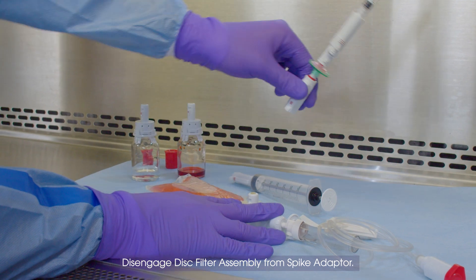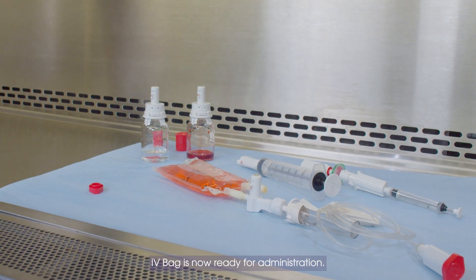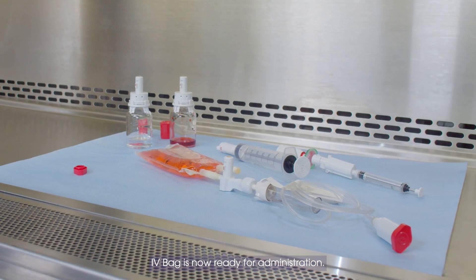Disengage Disk Filter Assembly from Spike Adapter. IV Bag is now ready for Administration.